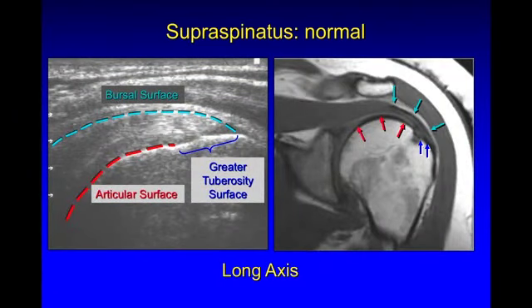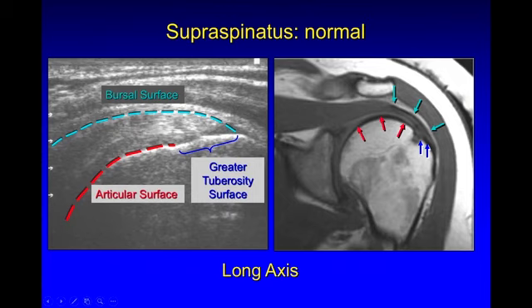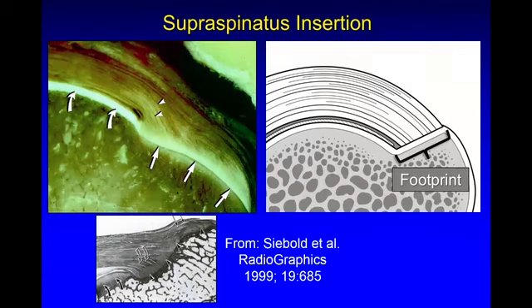We must be aware of the normal appearance of the tendon, and specifically the borders of the normal supraspinatus tendon. We have three different surfaces: the articular surface, the bursal surface, and the greater tuberosity surface, also shown here on MRI. The greater tuberosity surface designates the footprint of the tendon where it attaches onto the bone. This term is used at any tendon or ligament attachment onto bone where the surface of the bone is called its respective footprint.